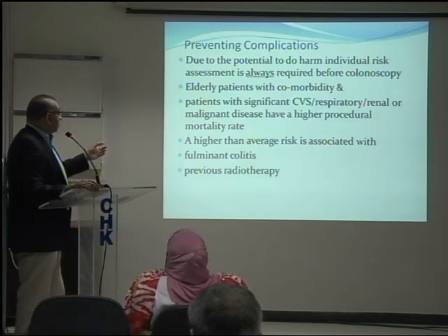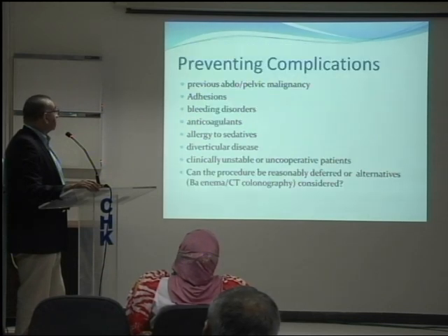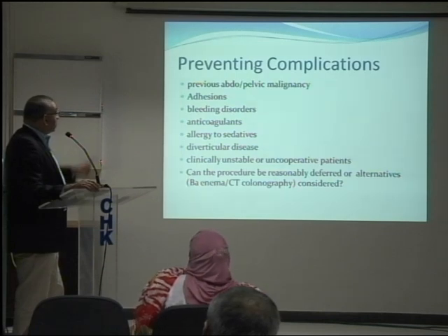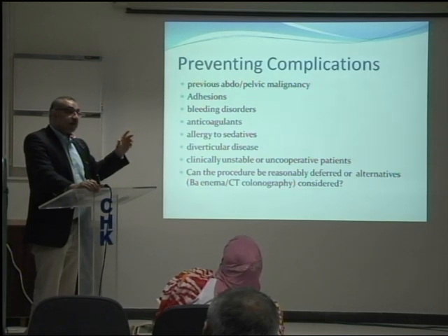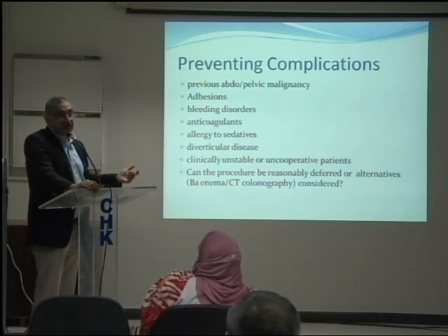You shouldn't do colonoscopies in fulminant colitis, and in patients with previous radiotherapy there is risk due to strictures and angiodysplasias. Anyone who has had previous abdominal or pelvic surgery, the commonest scenario being women who are post-hysterectomy, are a nightmare because of adhesions. Even in very good hands, they are more challenging to do.